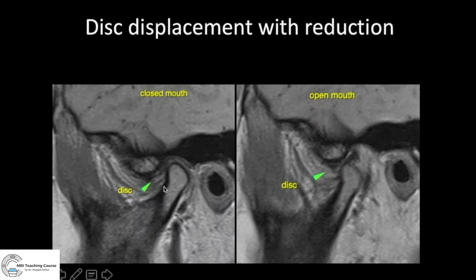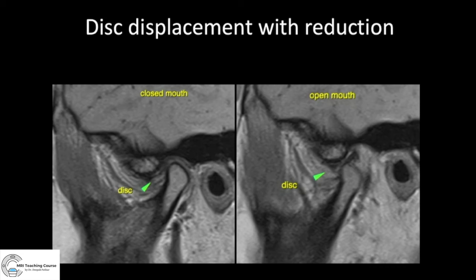Another example: look at the mandibular condyle, look at the disc — it is significantly anterior to the mandibular condyle, there is disc dislocation. But on open mouth, you can clearly see the disc is now in normal relation to the mandibular condyle. This is disc displacement with reduction.